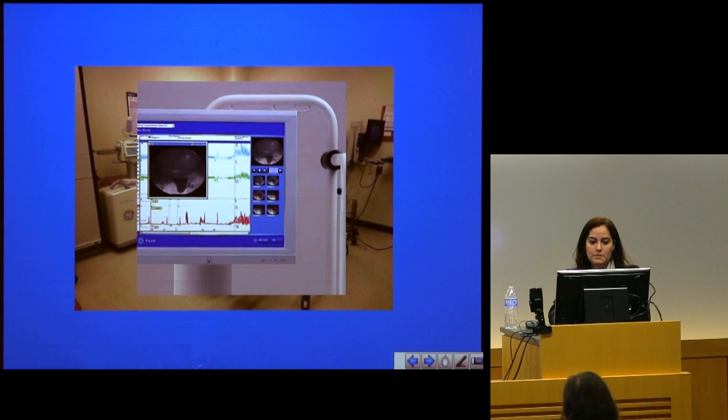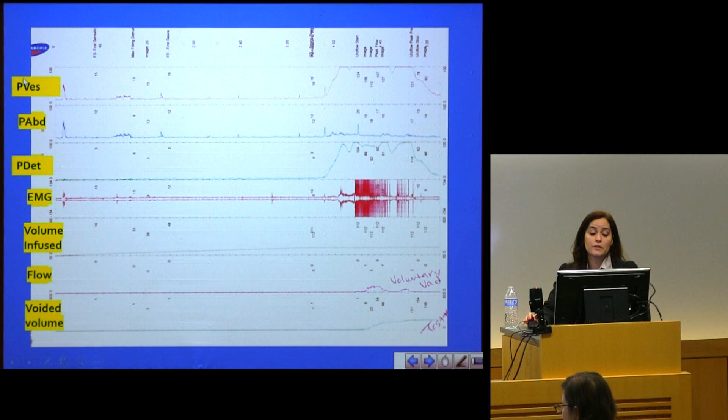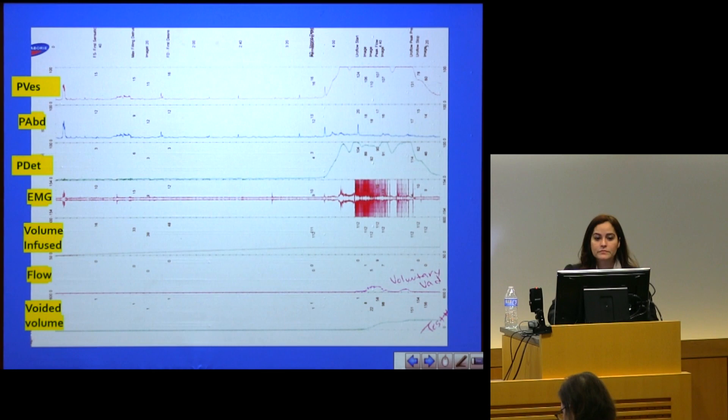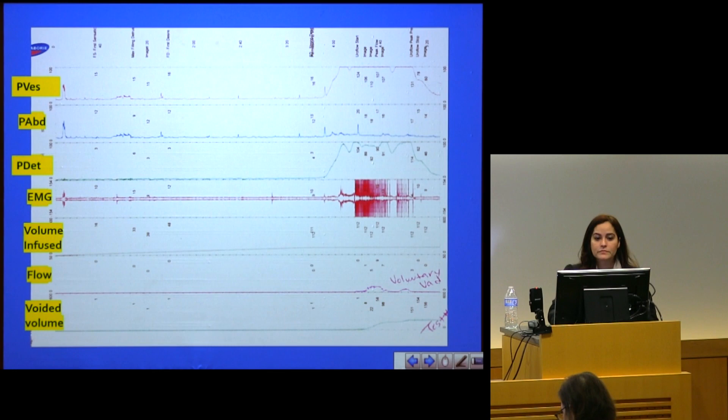This is a typical tracing. As I mentioned, you have a catheter that goes inside the bladder, one inside the rectum to measure abdominal pressures, and the subtraction of those gives you the pressure inside the actual bladder muscle — which I'll refer to as the detrusor muscle. We also have EMG, and we measure the volume infused to determine capacity, the flow during the voiding phase, and the voiding volume. The test is divided into two phases: filling phase and voiding phase.